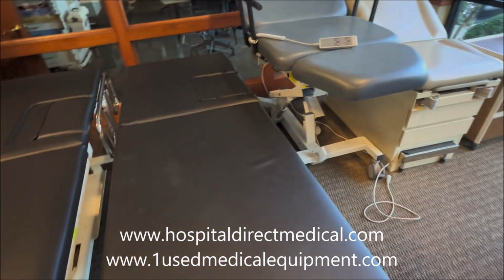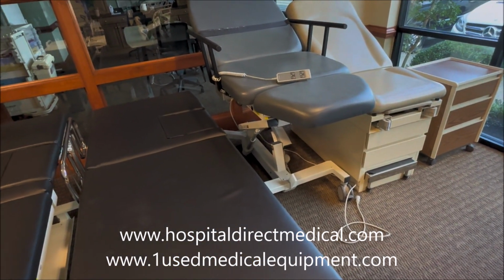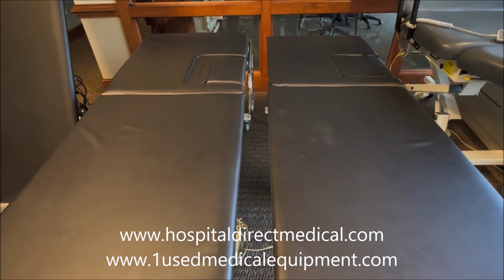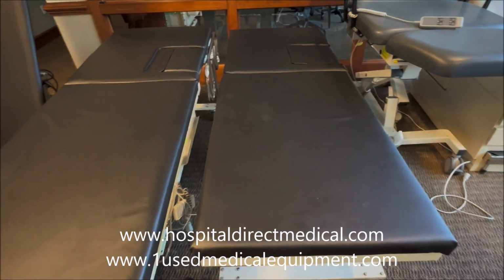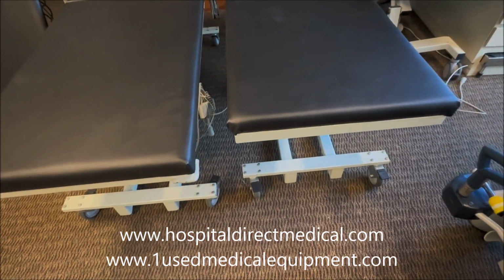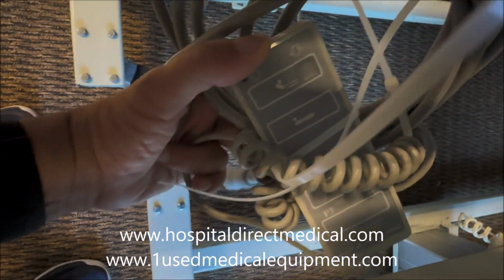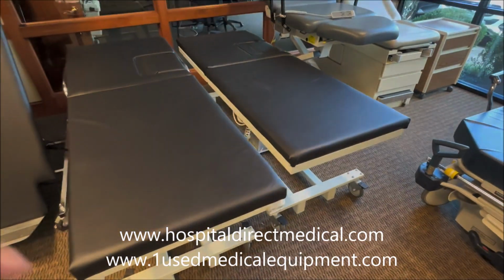When you're looking at ultrasound, this one here could be used for multiple functions because it's up and down. It's almost like a power exam table at that point. But when you're looking at the differences between a cardiac ultrasound table and a vascular ultrasound table, like I said, one's going to have Trendelenburg, one's going to have a footpiece. These obviously don't have any footpieces, so even if they had Trendelenburg, you would still need an additional piece on these, but they don't, and you almost always know they don't. And once again, head up and down, power up and down, which is what you want for a vascular ultrasound table.